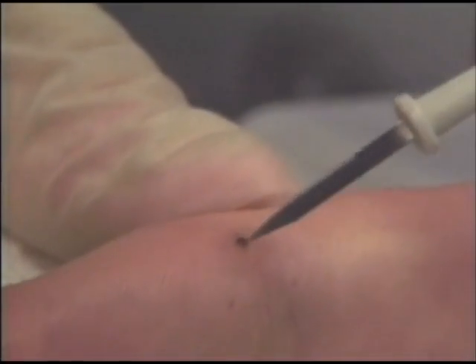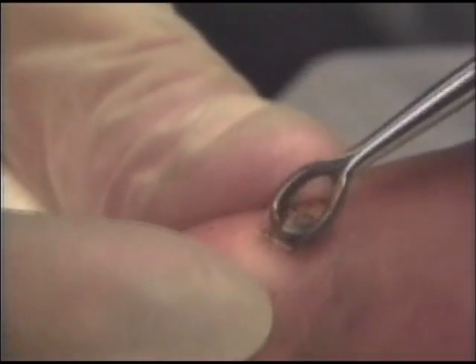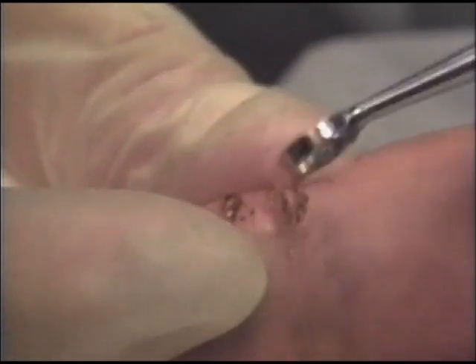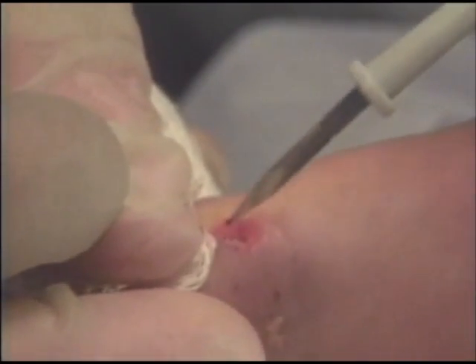The treatment of viral warts is similar to that of seborrheic keratosis. Warts may penetrate more deeply into the dermis so that additional power is needed for electrodesiccation. The wart is first desiccated before curettage. Scrape off the tissue with a skin curette, being careful to not go too deeply into the dermis because of the underlying nerves and blood vessels and an increased risk of scarring.